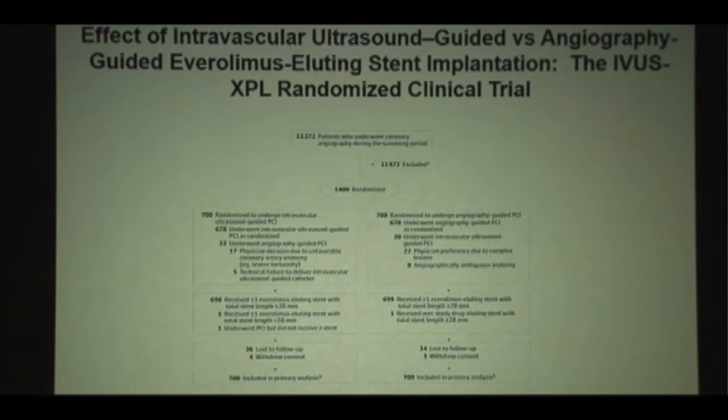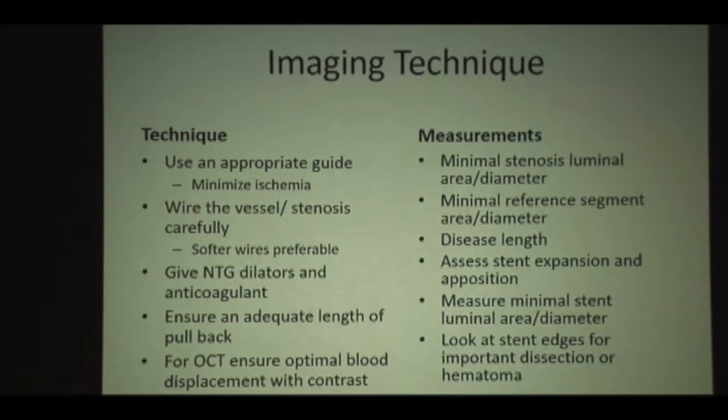Now, up until recently, we had no definitive evidence saying we should use imaging to guide coronary stent implantation; we didn't have the evidence to show that it improved outcomes. The imaging technique is pretty straightforward. Just a few suggestions: when you do this, you shouldn't complicate the procedure at all.